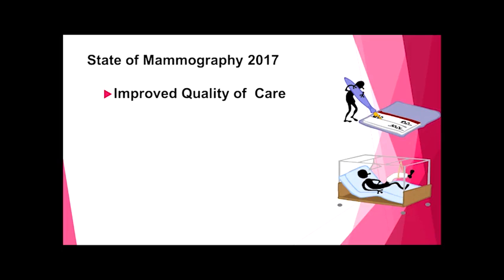So, improve quality of care of patients. We're all healthcare consumers, whether we work in the healthcare industry or not, but we all consume healthcare for us, for our families. And we all want the same thing. We all want to be treated appropriately and receive the best quality of care because obviously we're paying top dollar.